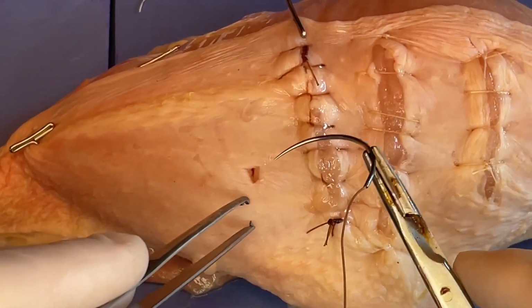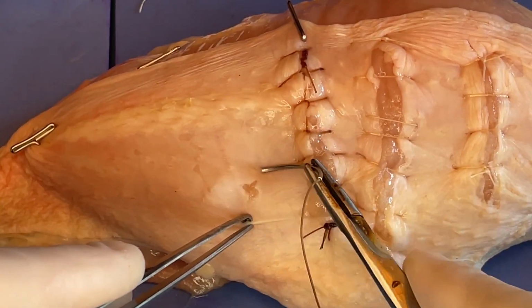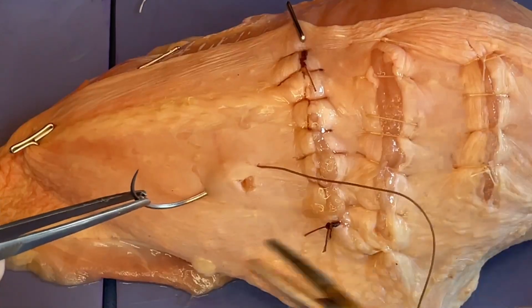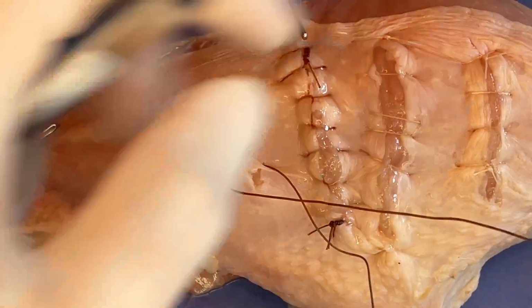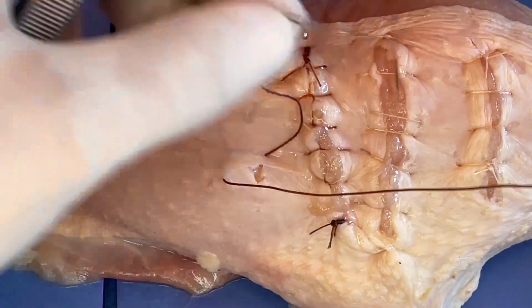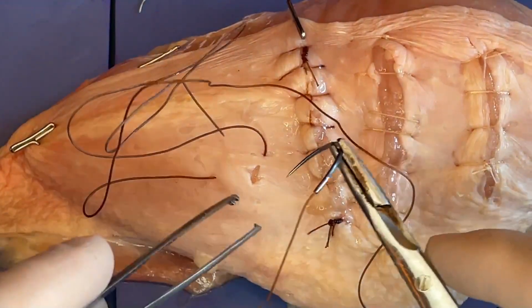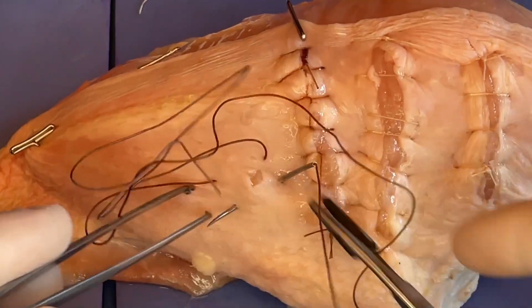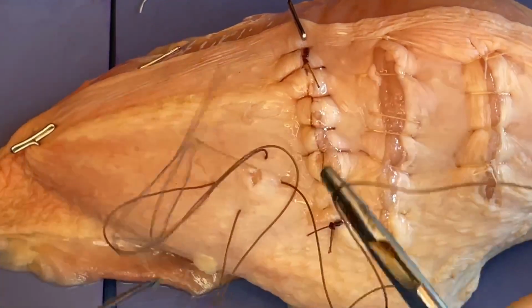So if we really wanted to make sure this is hemostatic, what we do is come up above it, and this is a little bit of a big needle for this, but we come up above that area with our first pass. So you can see we've got there above, and then our second pass we come just below it, so just keeping that area of bleeding right in the middle of our suture.